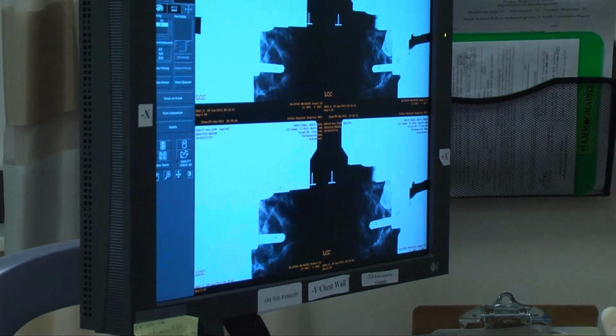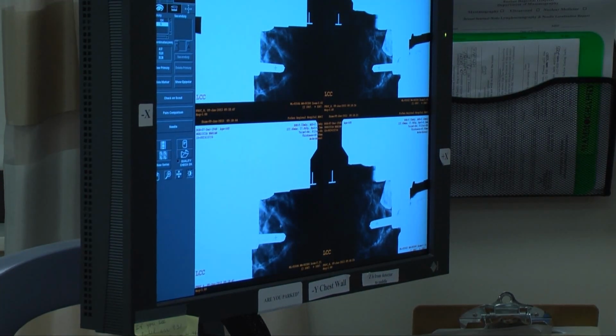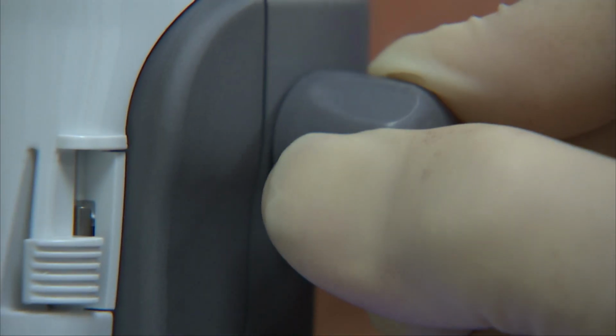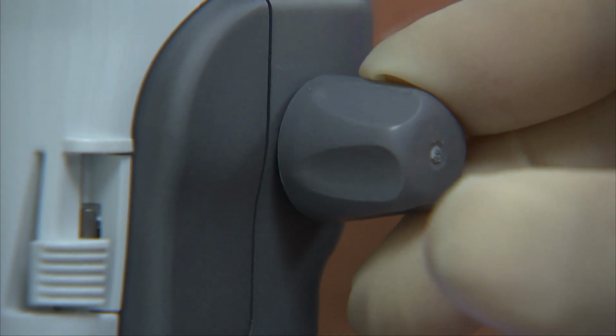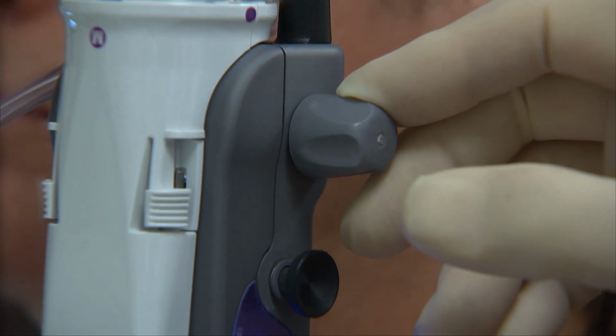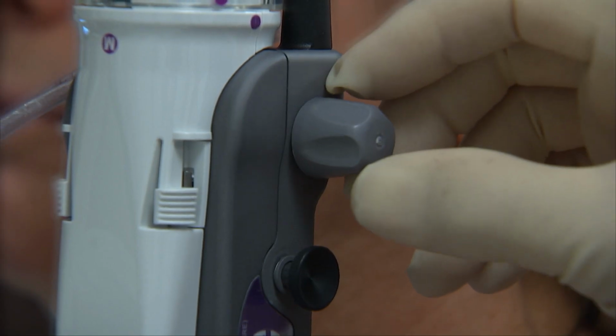Okay, so look, the calcifications are right over the bowl. And we're ready to go. I'm going to just put the clock at 12 o'clock. And the way we do it is I go even or odd and not even, so I like to go around, I'll take 11 or 12 samples. Here we go.